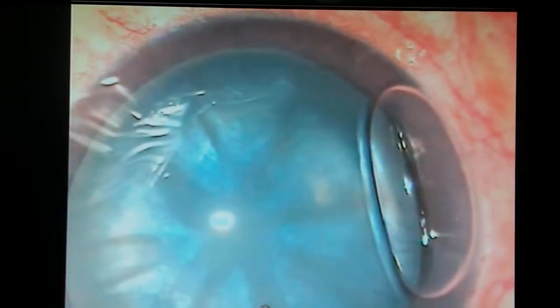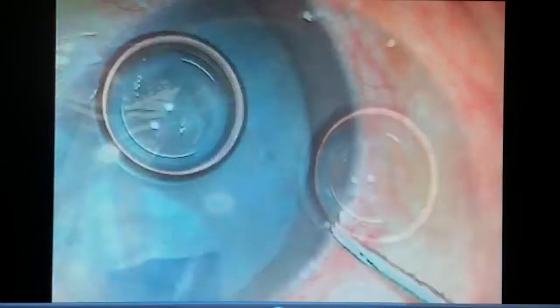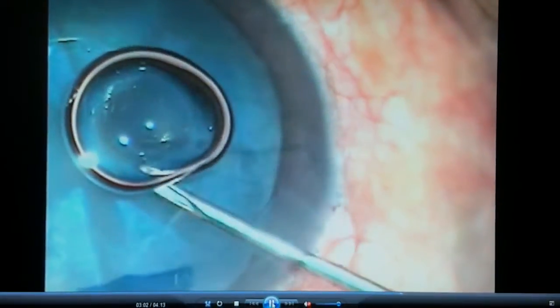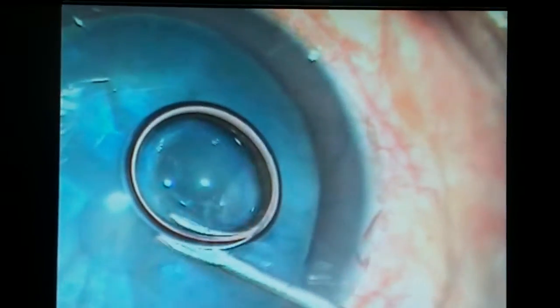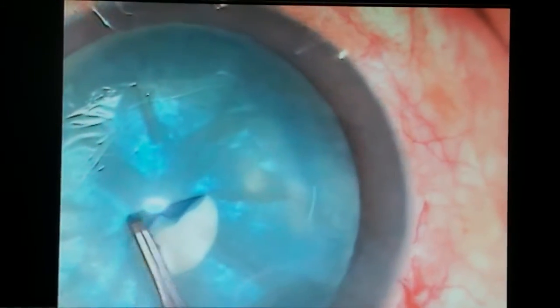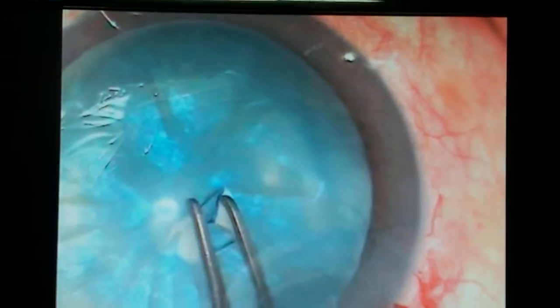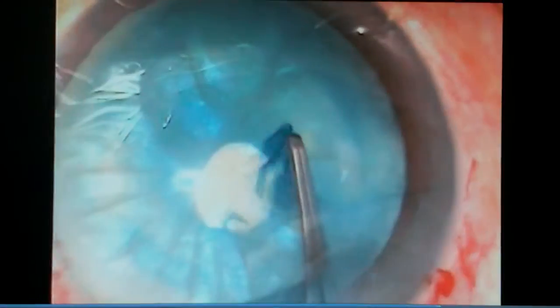I give a viscoelastic substance into the anterior chamber and another side port is made at 2 o'clock. Now I begin the rhexis — the anterior capsule is punctured at the center and a very small rhexis, a mini-rhexis, is done.